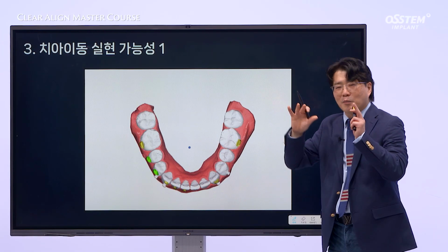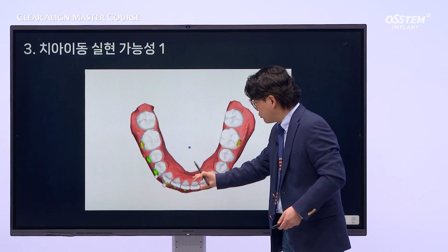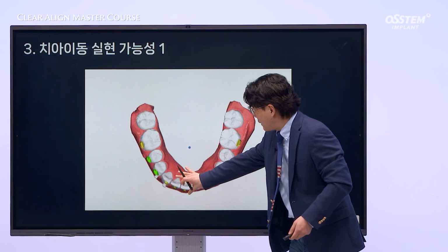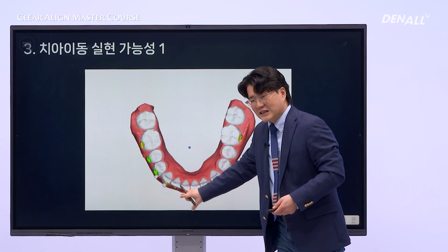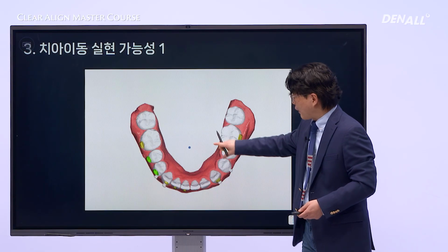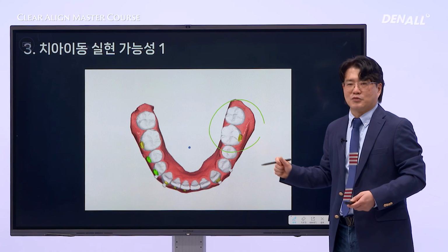When a treatment plan is proposed, can we expect the teeth to move as planned just by wearing aligners? Absolutely not. If one or two teeth start moving, then the third and fourth follow. Will the rest of the teeth just stay in place and neatly follow one by one? Of course not. The teeth that have already moved and the ones that are supposed to move next can act as anchors, pulling back the teeth that had started moving. These kinds of things can happen.